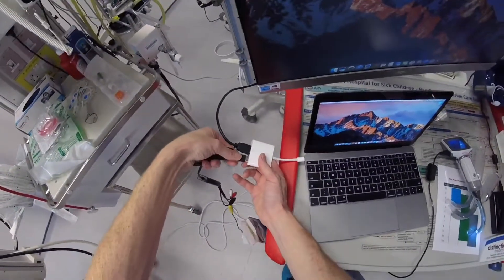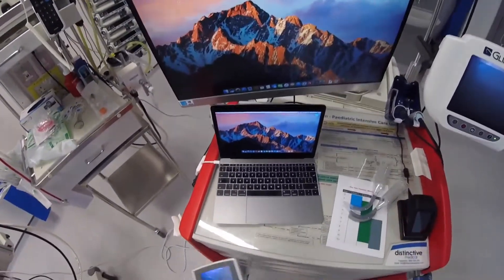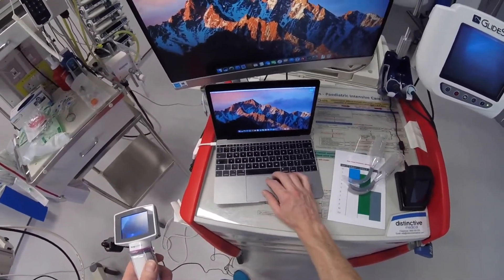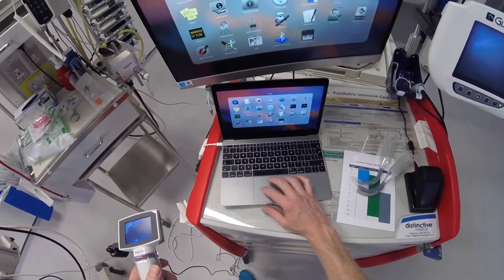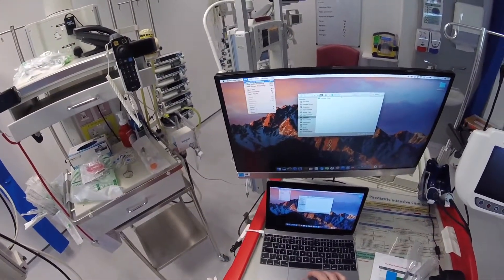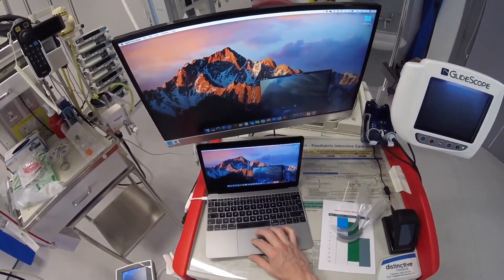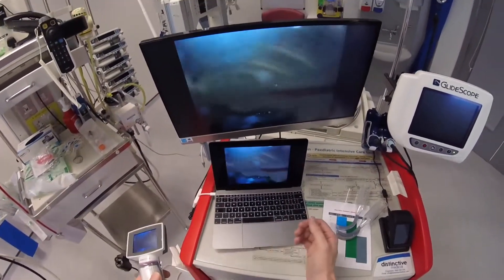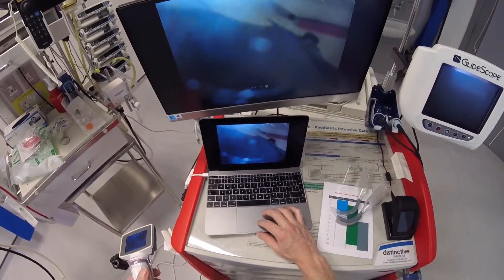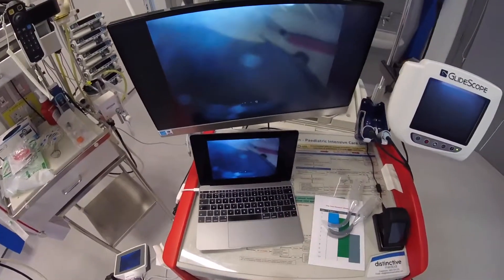We just plug in here. I'm using a Mac, so you would have to use similar software on your computer, but on a Mac the easiest way is to go to QuickTime Player, go to File, New Movie Recording. And there we go — we've now got footage mirrored onto a big screen. To record, just hit the record button, and you can record while you're doing the intubation, then hit record again to finish.